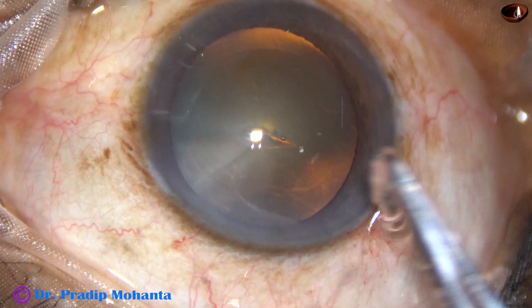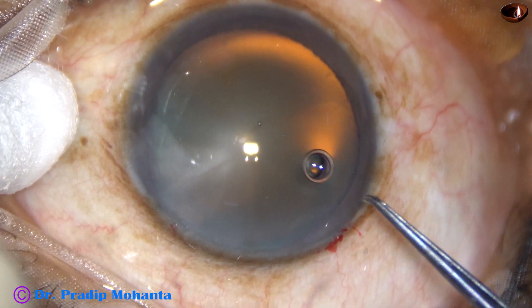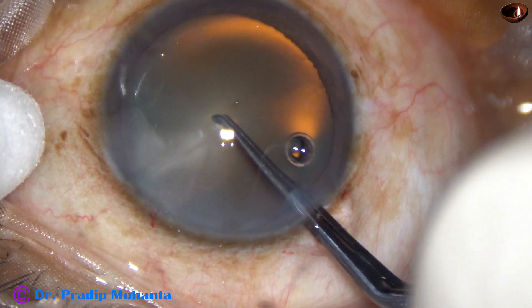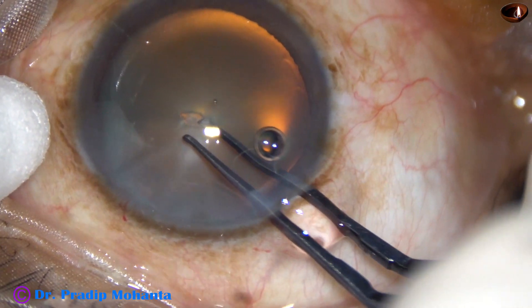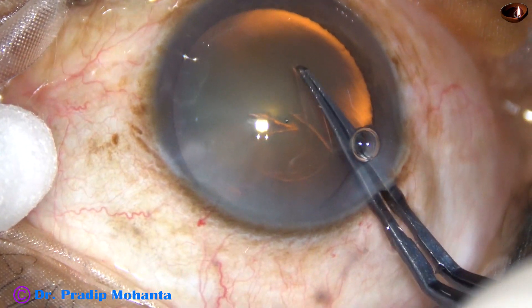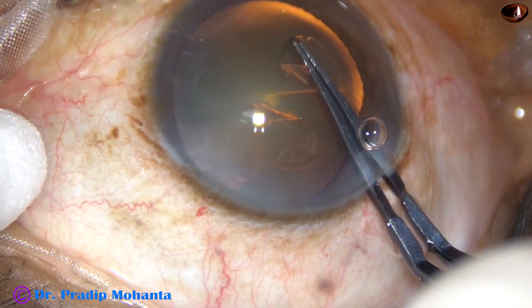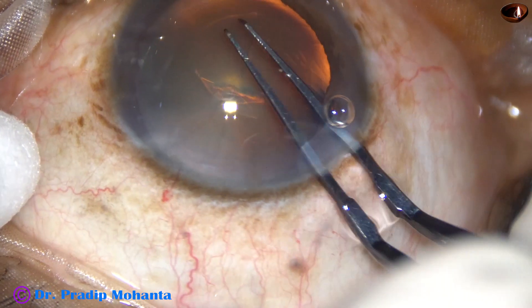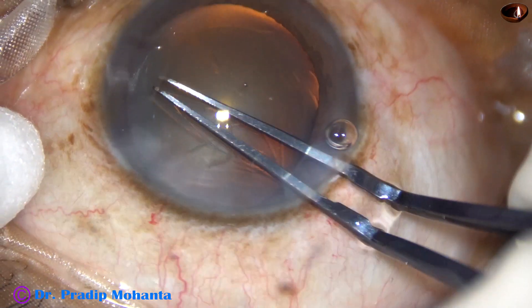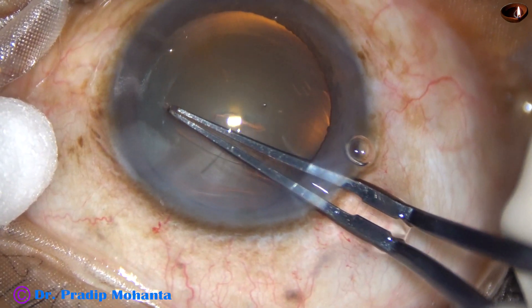The rhexis starts at 2 o'clock and it gets completed right there. When I use the needle, the rhexis starts at around 10 o'clock. The capsular tag is held — release, re-grasp, go anti-clockwise — remaining at a certain distance away from the margin of the dilated pupil, and thus you can get a fairly round rhexis.